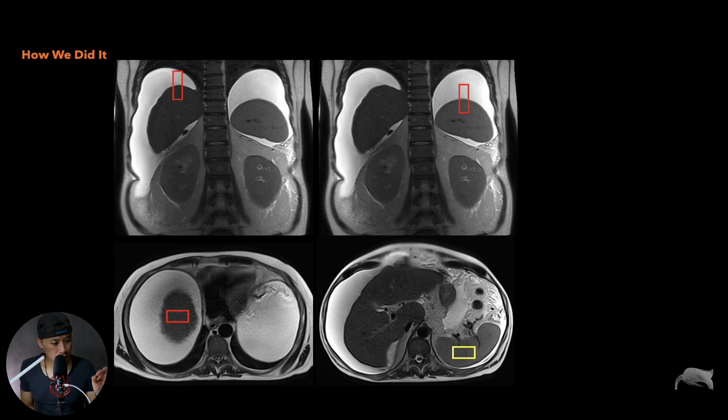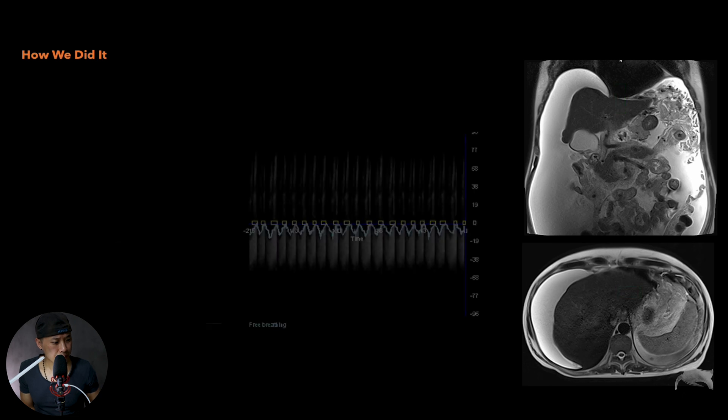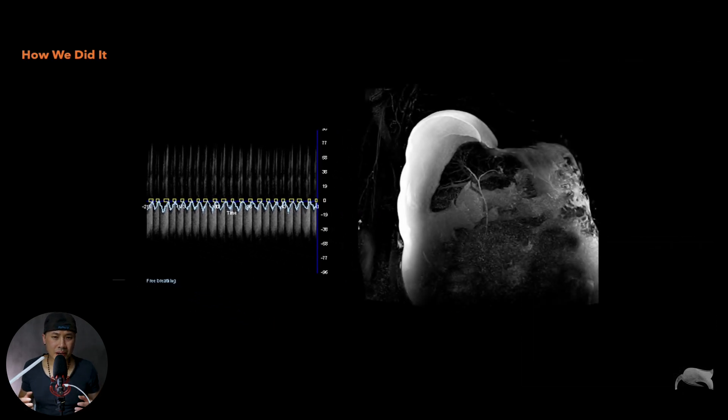However, on this case we did things a little differently. By scrolling up and down through the images, we noticed an area right here with no fluid — and it was consistent at the same point on multiple planes. So we placed the navigator there. It sounds very crazy, but believe me, it did work. The respiratory diagram showed consistent breathing curves, and the image results looked like this — not the best image, but we managed to solve the case. And that's the most important thing: solving the case in a difficult situation by thinking outside the box.